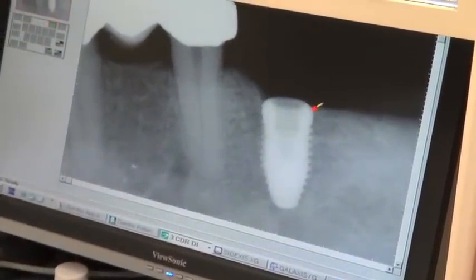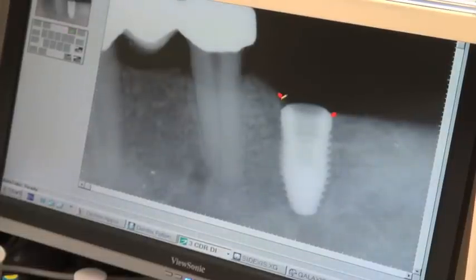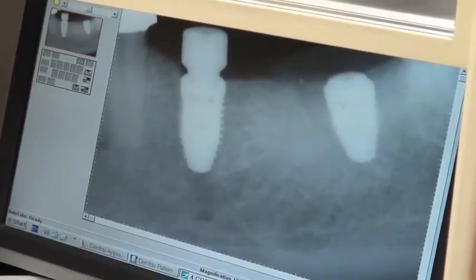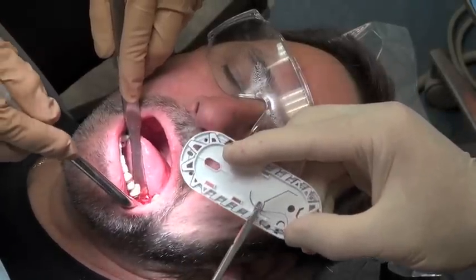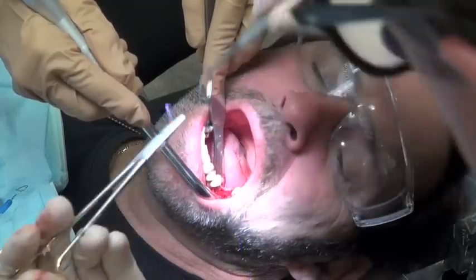We'll take an x-ray to verify that the implant is in a nice position. We can see the reference point for the implant — I use the lower reference point so I can place the implant at a nice level for when we go to restore it. We can see the platform, the 45-degree bevel, and also that the osteotomy is prepared approximately 1.5mm below the end of the implant — so you have to plan for this, staying away from the nerve below. After the healing abutment is on, we put a couple of sutures in, and then the patient will wait three months and come back to have this beautiful implant restored.